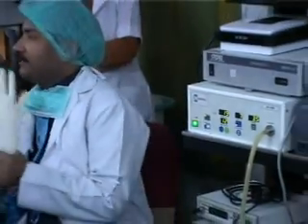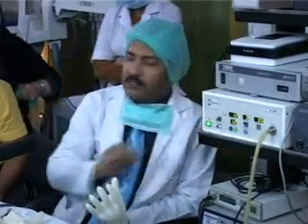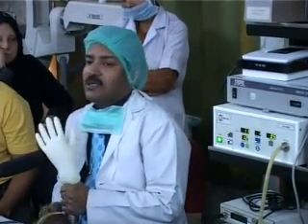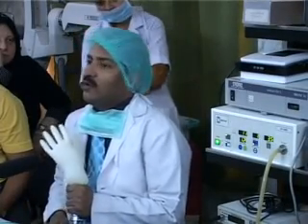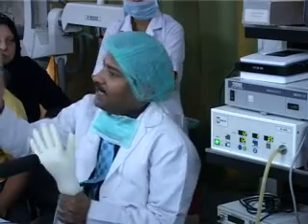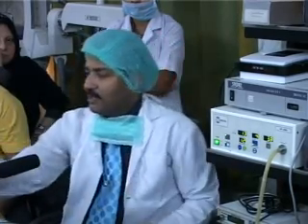So when your cannula is in, you should put your insufflator to 0 to max. What does 0 to max mean? 0 to max means that if it is required, the flow rate will be maximum, and if it is not required, the flow rate will be 0. And automatically the insufflator will decide. You don't have to worry about it. I will show you here.